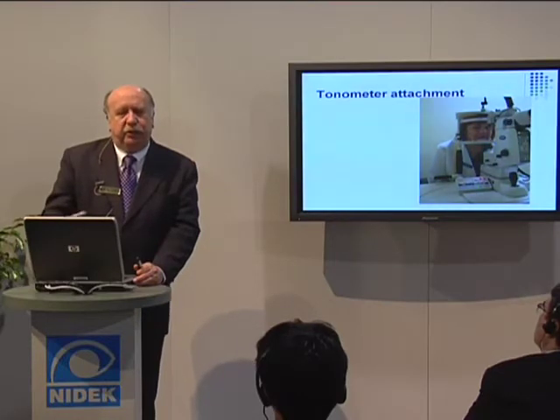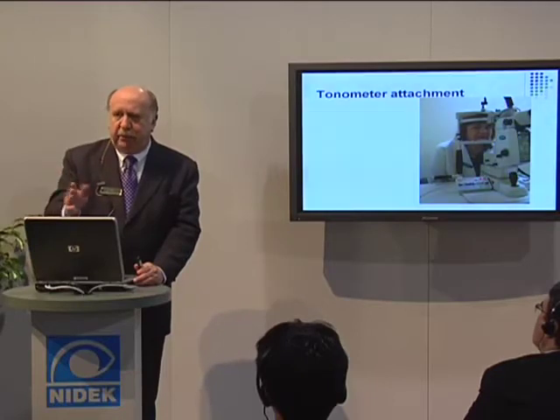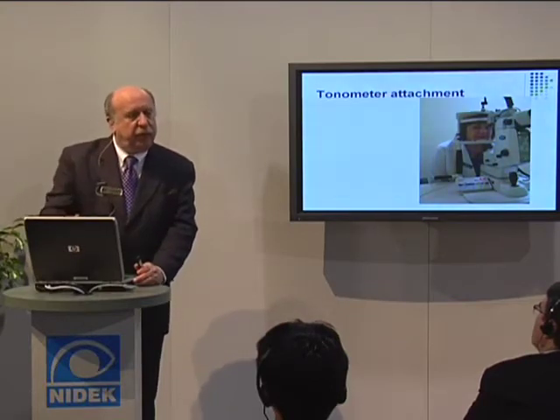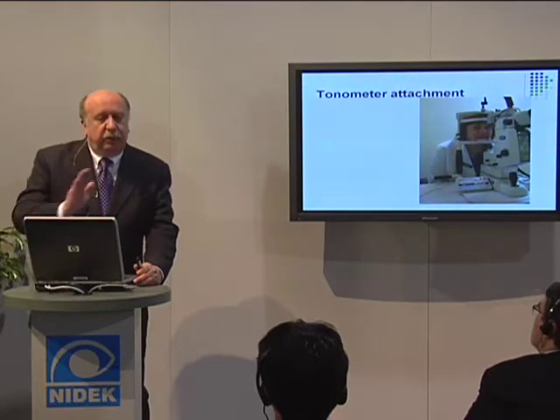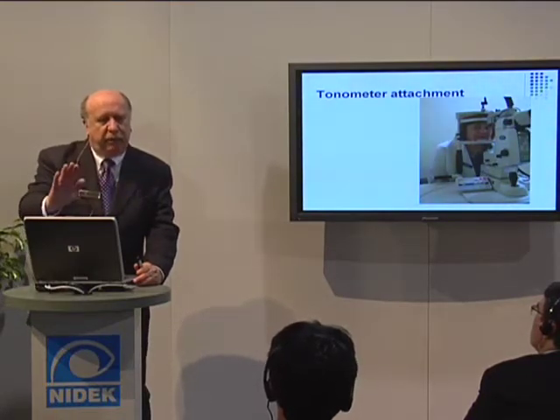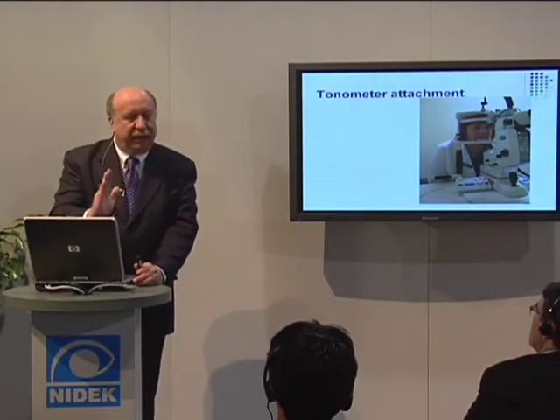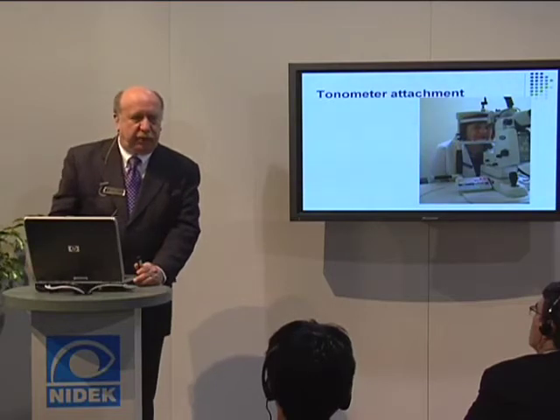So this is a restriction to that prism system that we talked about versus the split prism, where you can swing it aside and then keep your aiming beam and your treatment beam straight ahead and able to treat both in the anterior segment and the posterior segment with plenty of illumination. When you have the prism system, you don't have the illumination going all the way to the back because it's tilted slightly. It's more set up for the YAG laser, and it's very dim into the posterior segment.